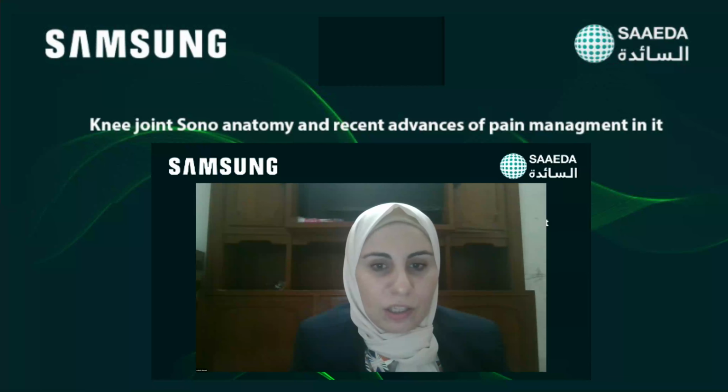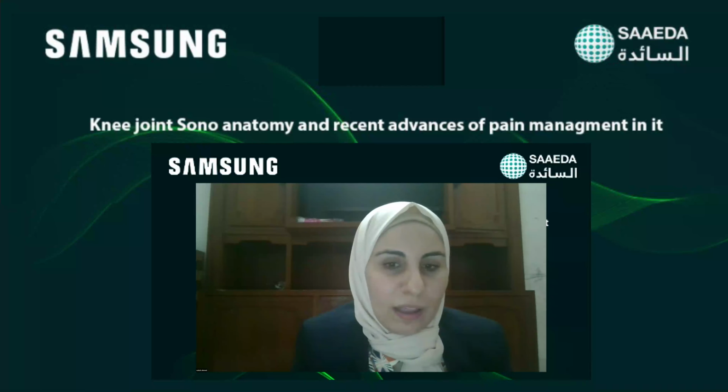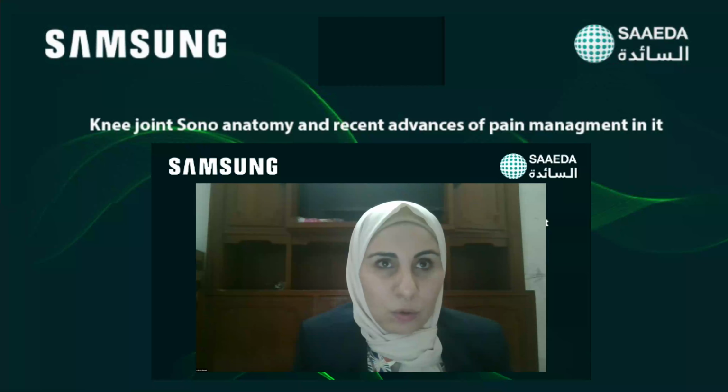There is another question, Dr. Sushba, sorry for annoying you. I say that ablation should be done in the axial, not longitudinal view, as Dr. Gautam also said. Someone asked why ablation is done in the axial, not longitudinal view. My answer is that it makes the needle more parallel with the nerve and avoids vascular injury. What do you say about that?